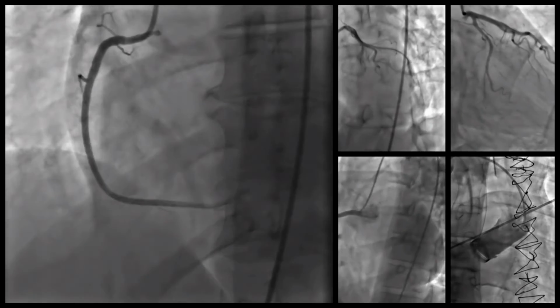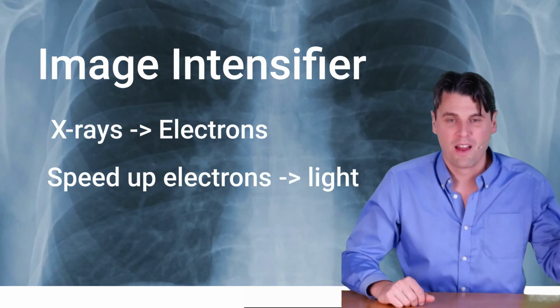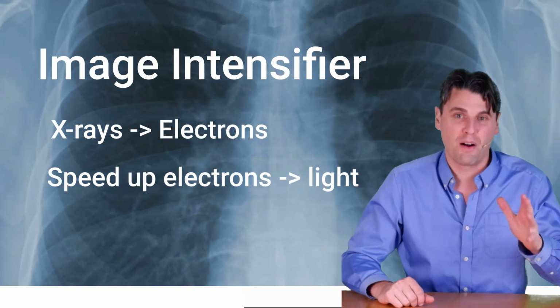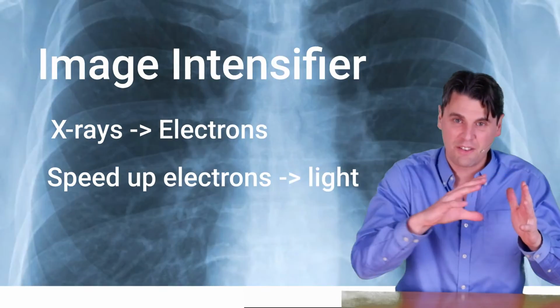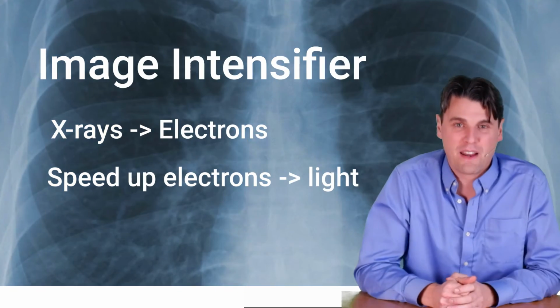All right, Rad Nation. Today we're talking about fluoroscopy, especially image intensifiers and their role in modern fluoroscopy. All the great details about how you actually convert from X-rays, you get electrons, and then those electrons get amplified. Coming up here at How Radiology Works.